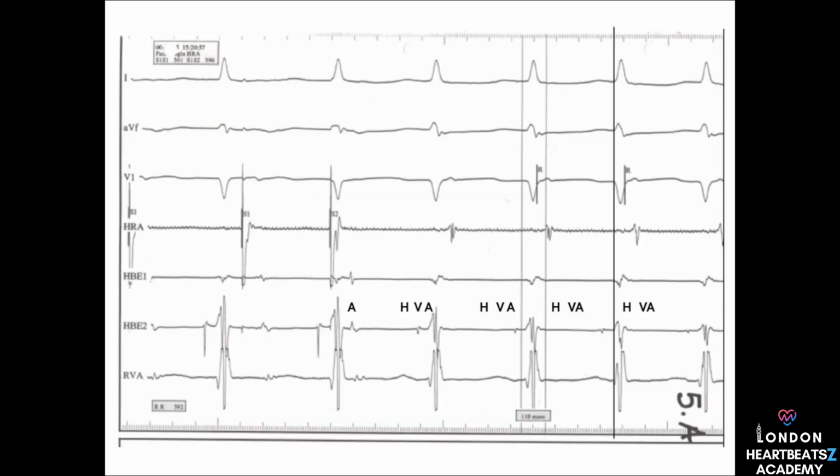Exactly. Okay, let's look at figures 5A, 5B, and 5C. These are showing us induction of both common and atypical AV-nRT using atrial extrastimulus pacing. So different flavors of AV-nRT. Right. Figure 5A, that's our classic common AV-nRT. Earliest atrial activation at the His bundle, retrograde conduction through the fast pathway, everything happening at the same time. Okay, so that's the usual suspect. What about atypical AV-nRT? What makes it different?